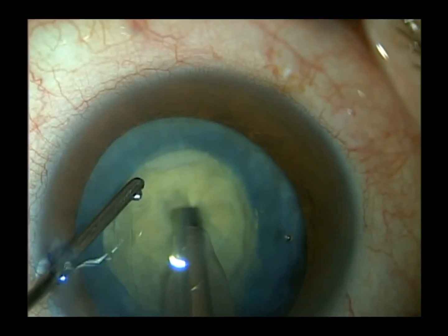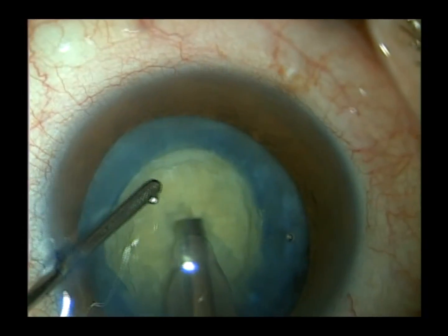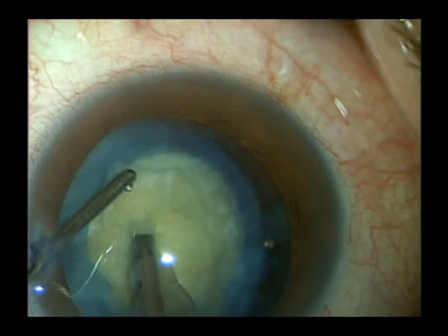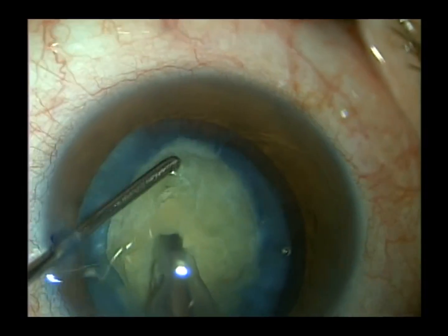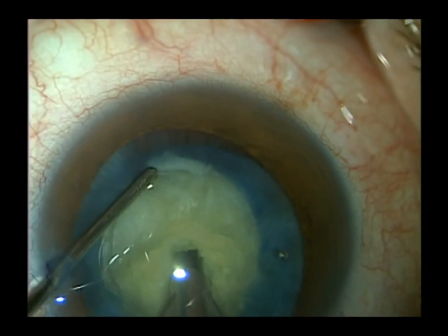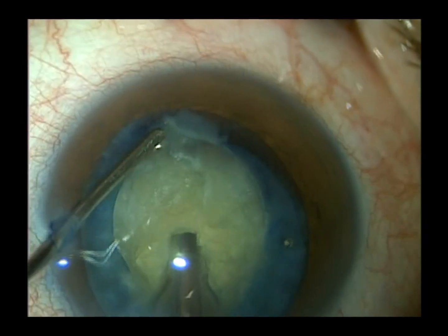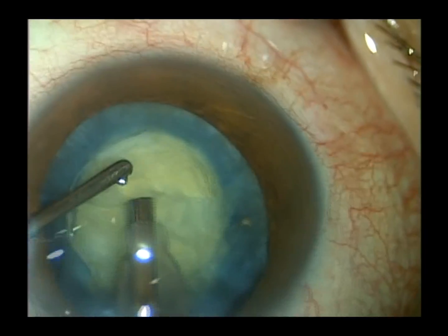When I try to make a central groove, I realize this white cataract is rock hard — it's hard to make a central groove unless I push posteriorly pretty hard on the lens. Not knowing how strong the zonules are, I choose to create a very shallow groove and then use my second instrument as a chopper. I'll elect to chop this lens rather than do a divide-and-conquer, chopping it once and then repeatedly as I rotate it.